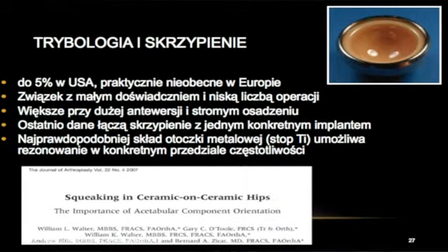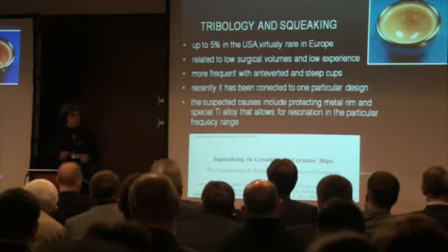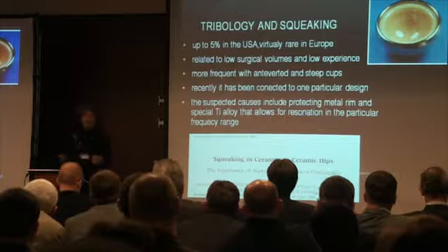That's why the incidence of this dry contact is very high. So this is the boundary lubrication in ceramics, which would not occur in optimally placed socket. But you need an amplifier, and especially with the particular type of stem, it was relatively soft titanium alloy that amplified the sounds so that they became audible.